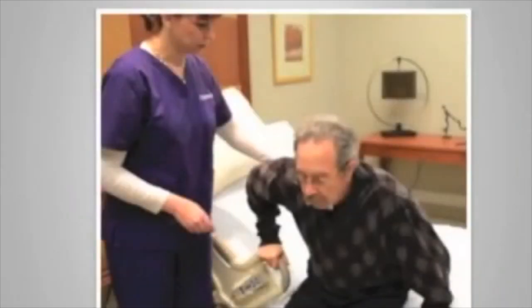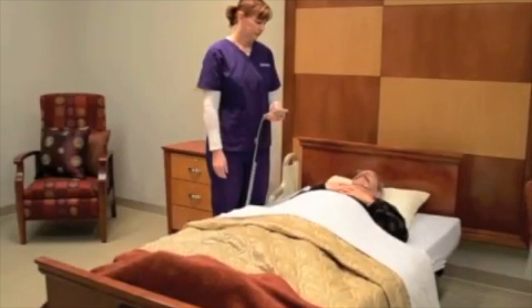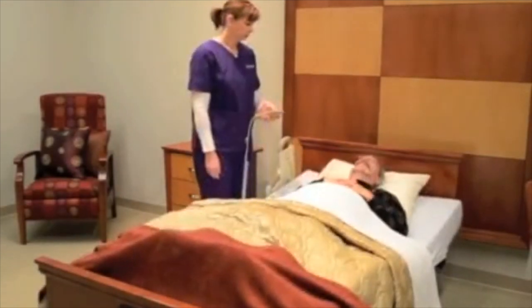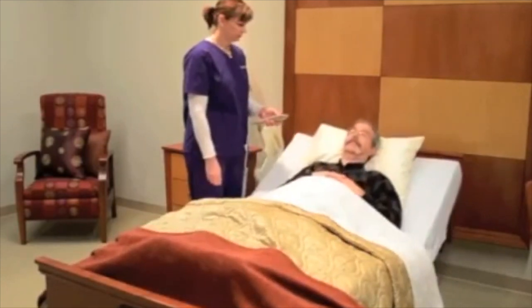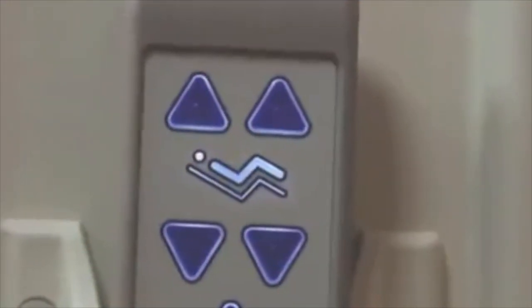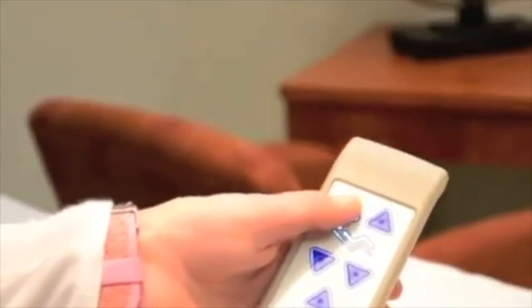When transferring residents in or out of bed, caregivers should raise the knee section of the bed first. Then, raise the head section of the bed. This will minimize residents from sliding down in the bed. To raise the knee section, press the up arrow on the right side of the hand pendant. Then, raise the head section by pressing the up arrow located on the left side of the hand pendant.